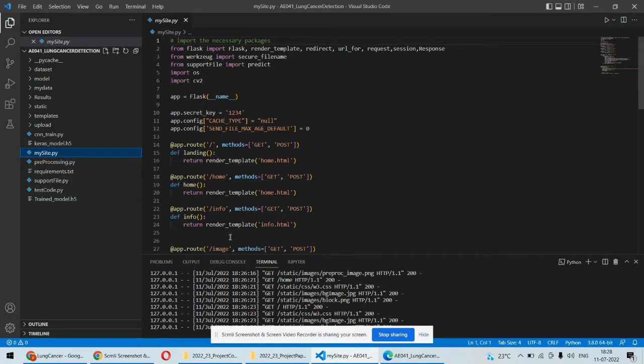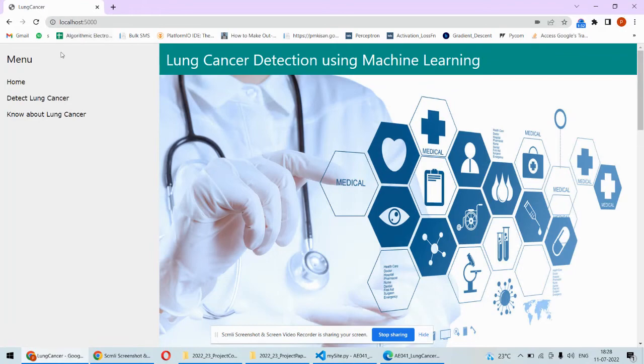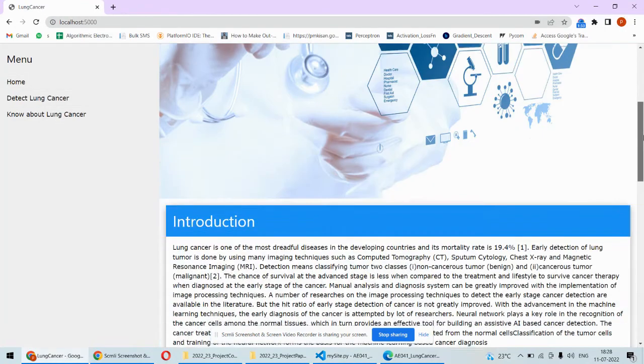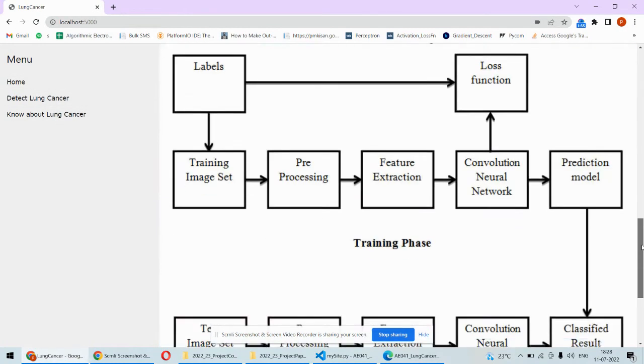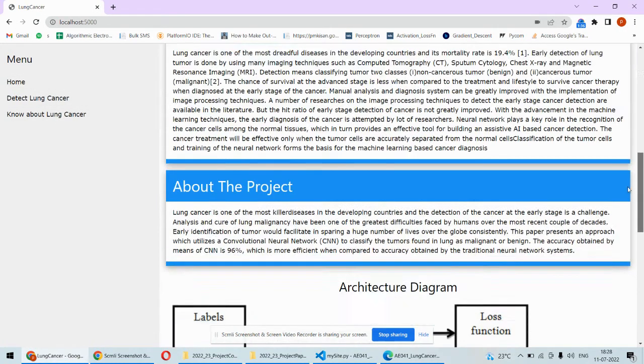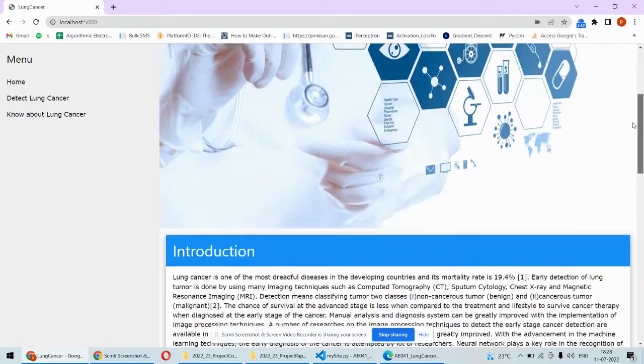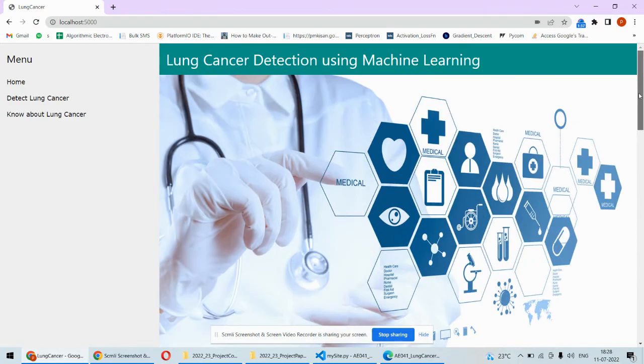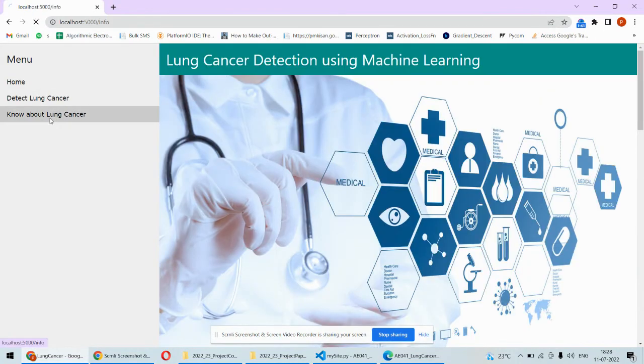Now once we run the project, this kind of interface we will find. So this is the front page and here you can add your own information as well.